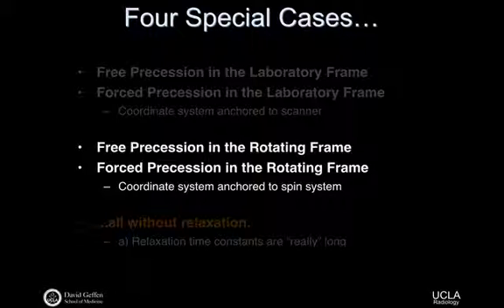Okay, so just to be clear, this is going to be free precession in the rotating frame. And we haven't gotten there yet, but this is still without relaxation.